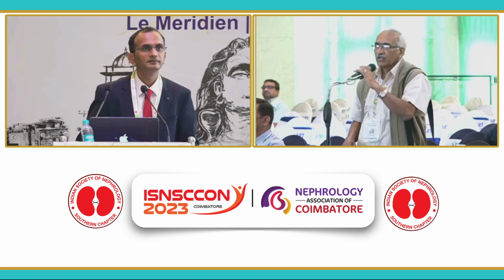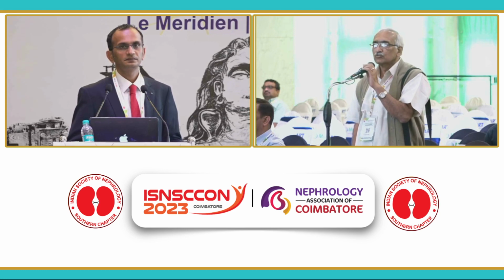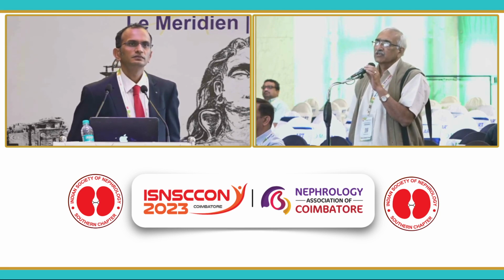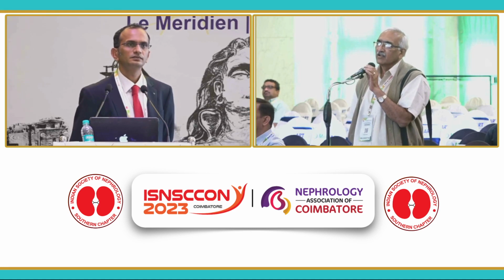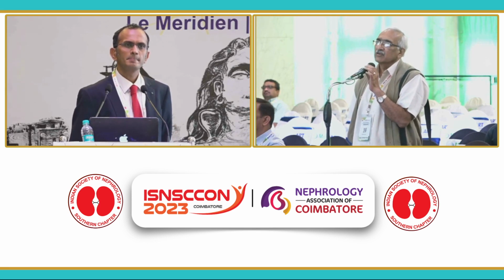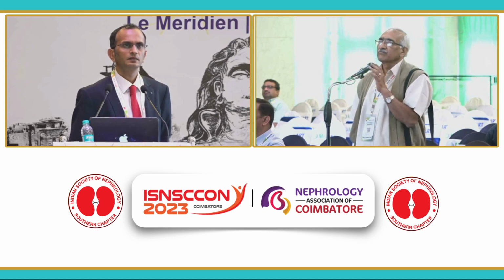Shivkumar, I congratulate you for the excellent work. There are two questions that I need to know. One is, scanning electron microscopic studies on the membrane of the hollow fiber, even on regular dialysis, have brought out a lot of morphological changes in the form of the surface becoming rough.